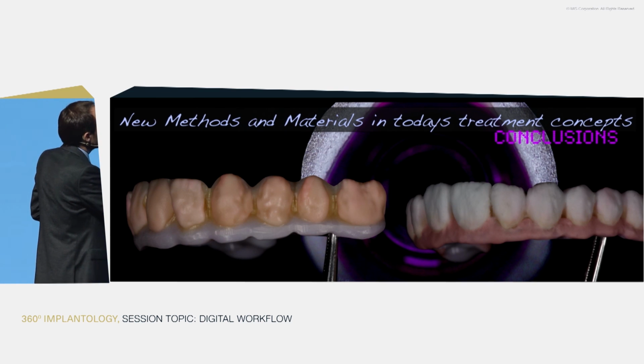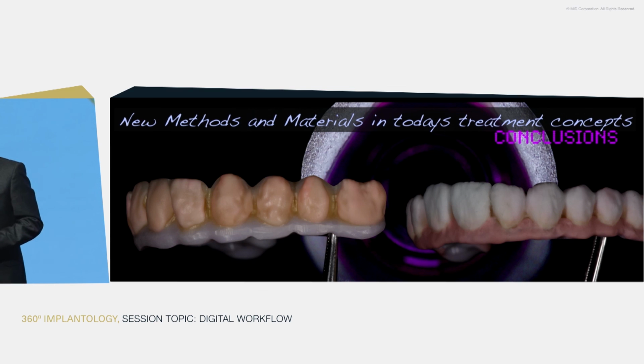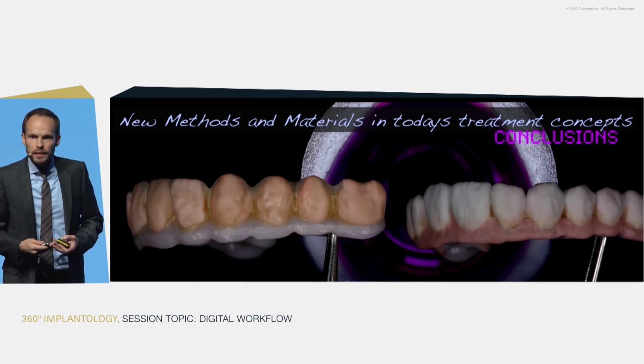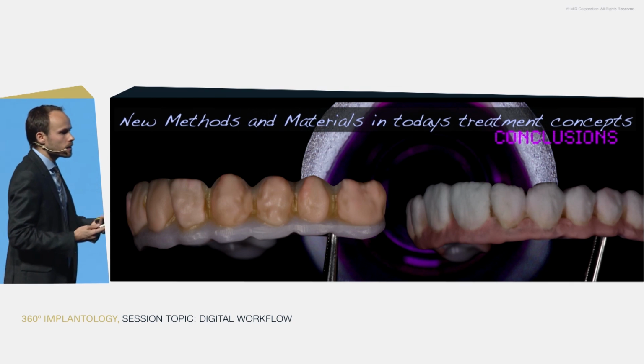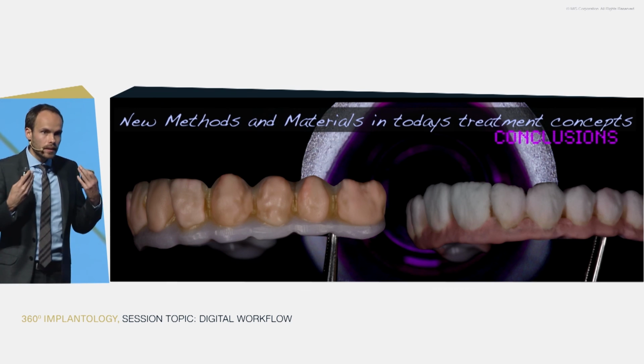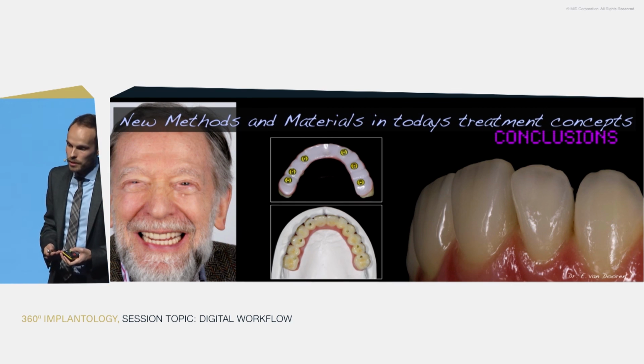This is a little bit of dentin, enamel, and some artificial gingiva, much faster than I ever was able to recreate this kind of cases. And once there is a chipping, it will be really minor compared to back in the days when we had massive chippings in these types of reconstructions.